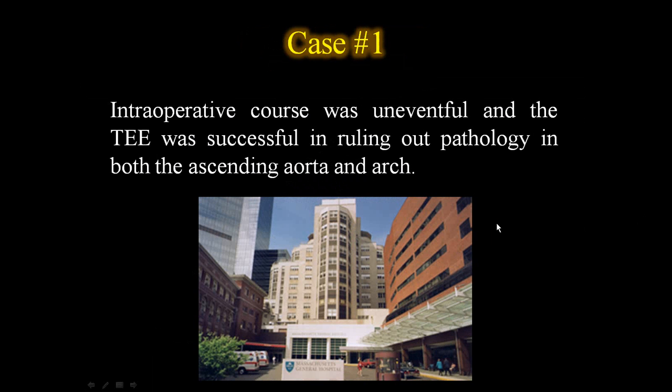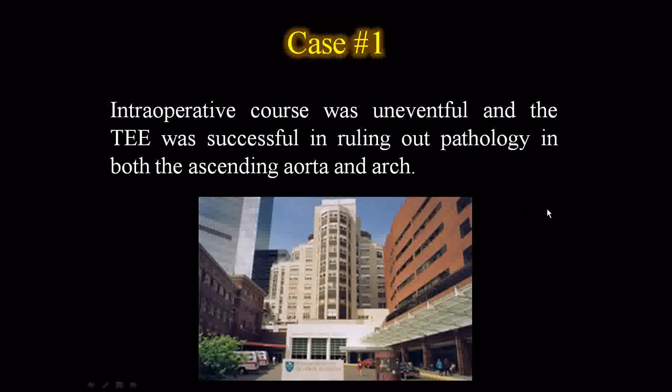The remainder of the intraoperative course was uneventful, and the TEE was successful in ruling out pathology in both the ascending aorta as well as the aortic arch.